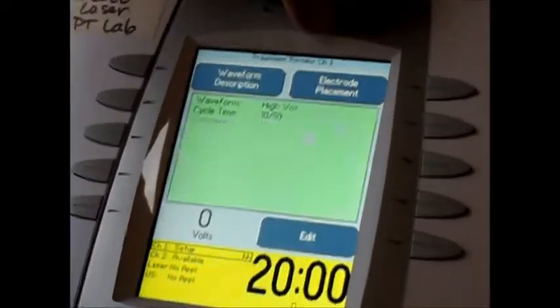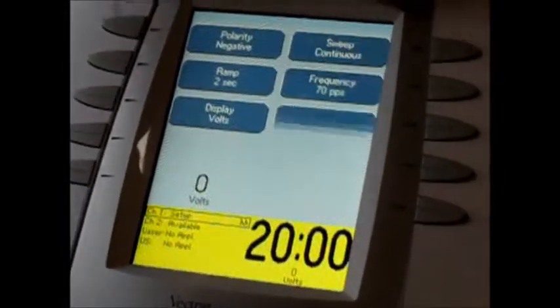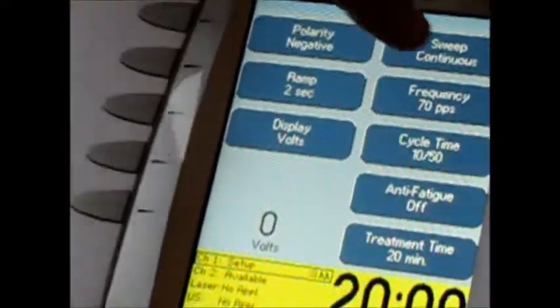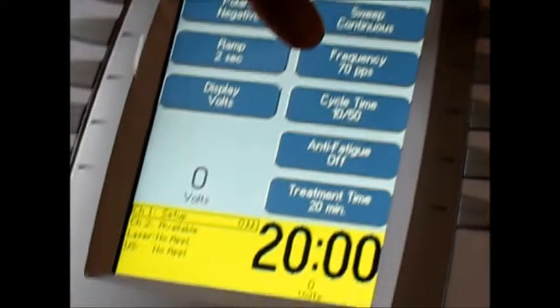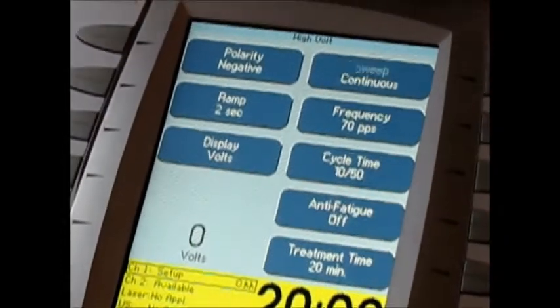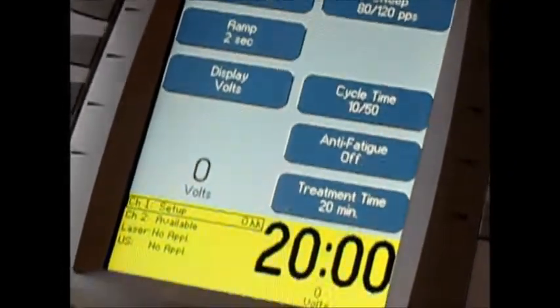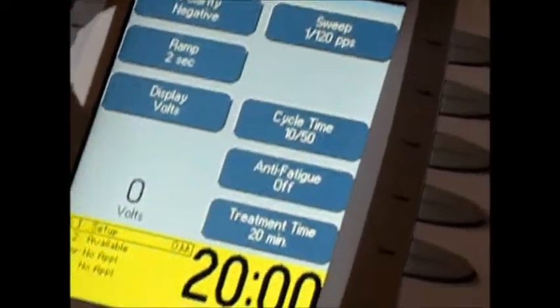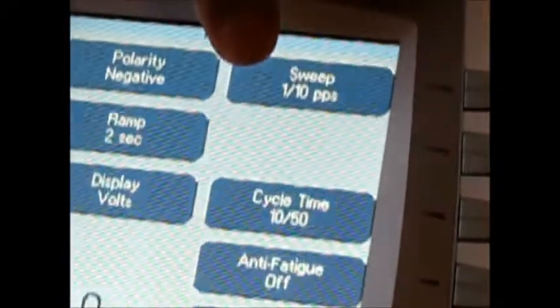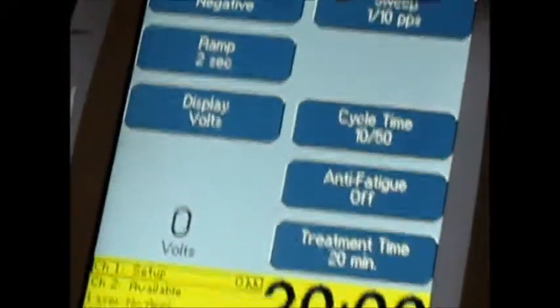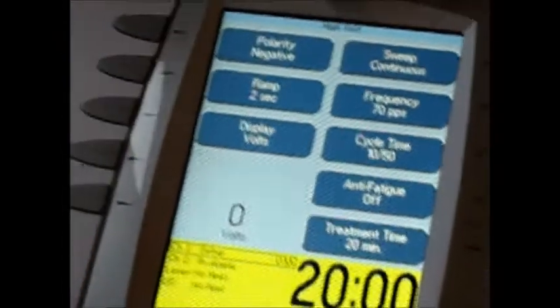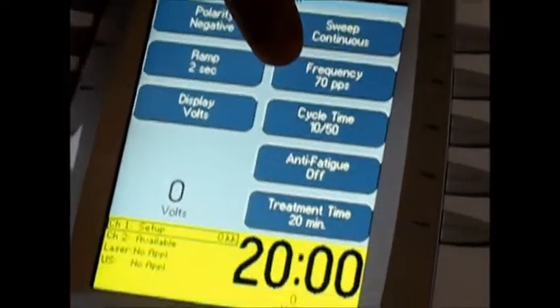If I want to do the same thing but have the person have a non-continuous sweep — not meaning it's only at 70 — I can actually change this and have it sweep from 80 to 120, or from 1 to 120. I can also set it for the 1 to 10 cycles per second for myofascial adhesions. Continuous is the only option apparently for contractive tetany.